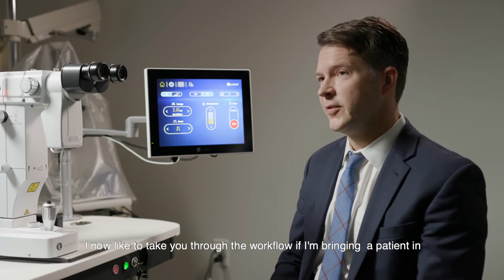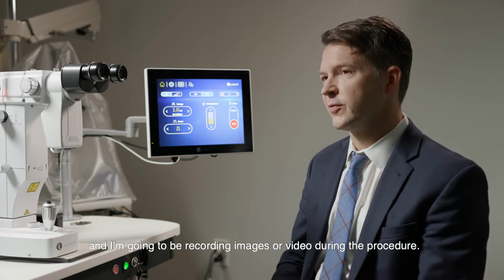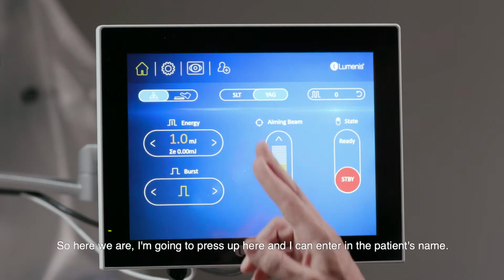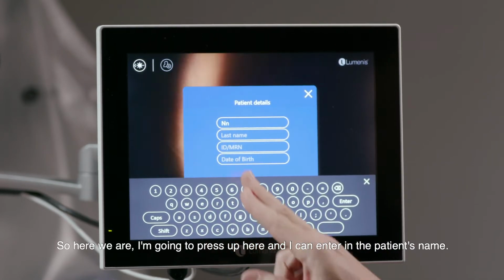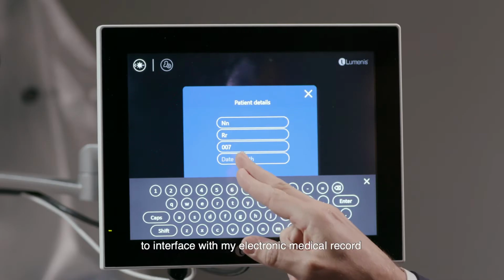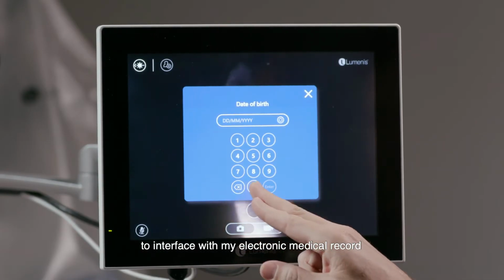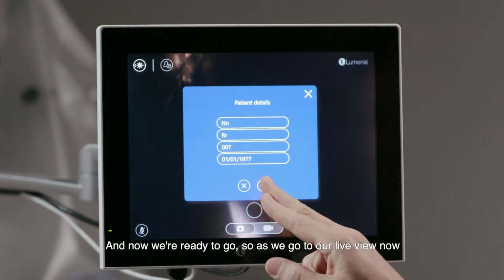I'd now like to take you through the workflow if I'm bringing a patient in and I'm going to be recording images or video during the procedure. So here we are. I'm going to press up here and I can enter in the patient's name. We enter a medical record number. This will allow it to interface with my electronic medical record, and a date of birth. And now we're ready to go.